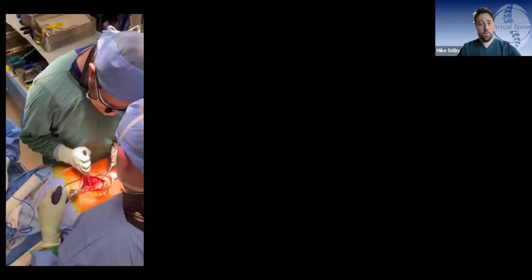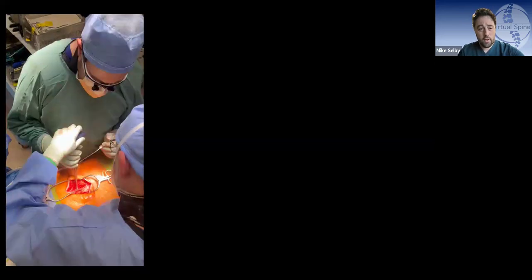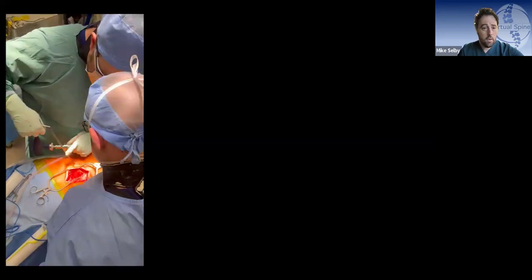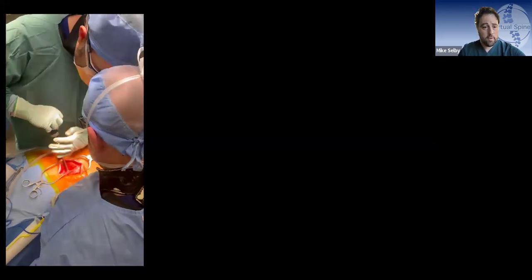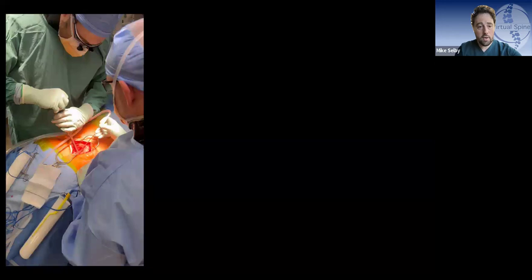So we took this on surgically with revision using a prone lateral approach where we can simultaneously access the posterior implants for removal. And this is just a little video of us starting the operation posteriorly. We're able to use Wiltse approaches via a midline skin incision to remove the implants, sort of minimizing the surgical trauma to the patient. I do find getting implants out that I didn't put in through percutaneous screws, through percutaneous stabs, quite challenging.